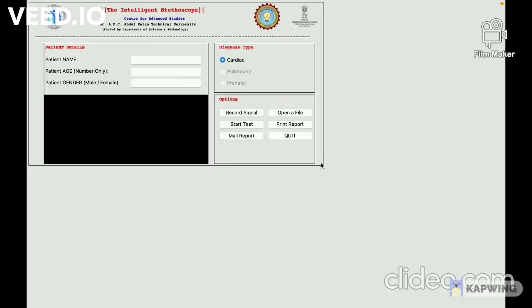Welcome to the GUI of the Intelligent Stethoscope. Patient details can be entered here: patient name, patient age (numbers only), and patient gender — male or female.